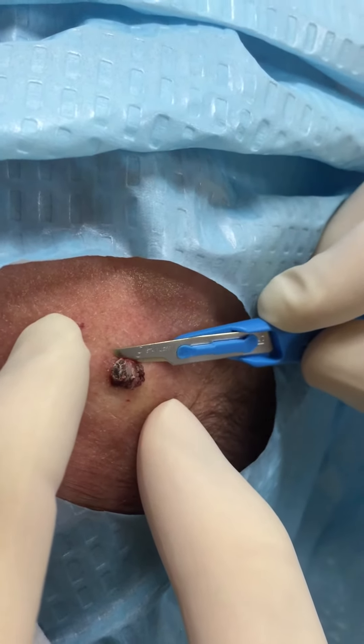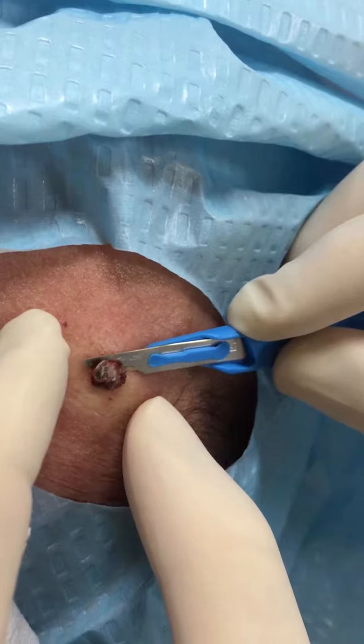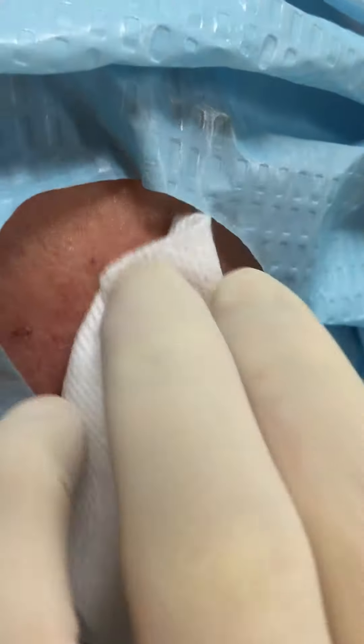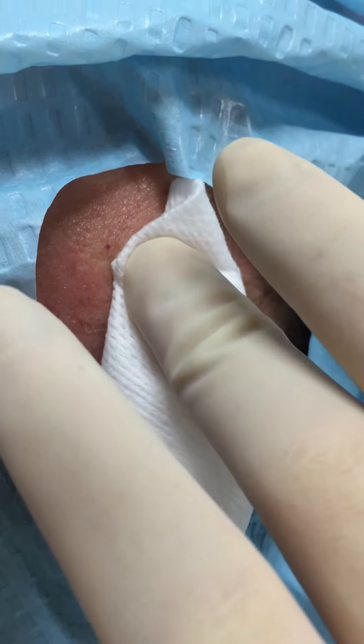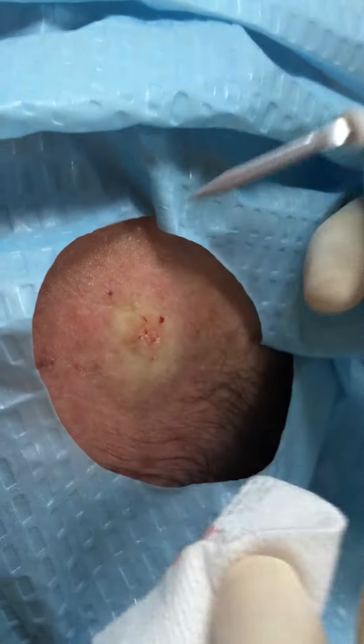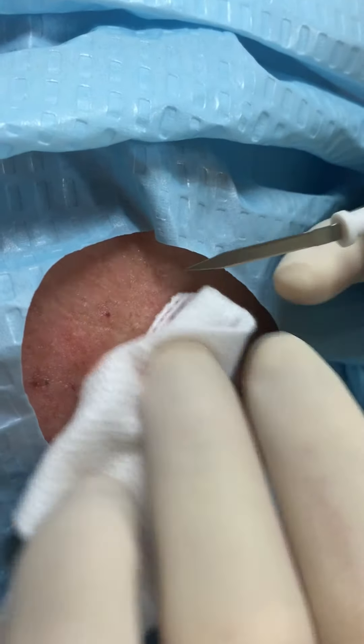I'm just going to shave out of the top hole. The pathologist can have a look at it for us. The bottom bit, I'm just going to treat that. It'll stop bleeding at the same time.